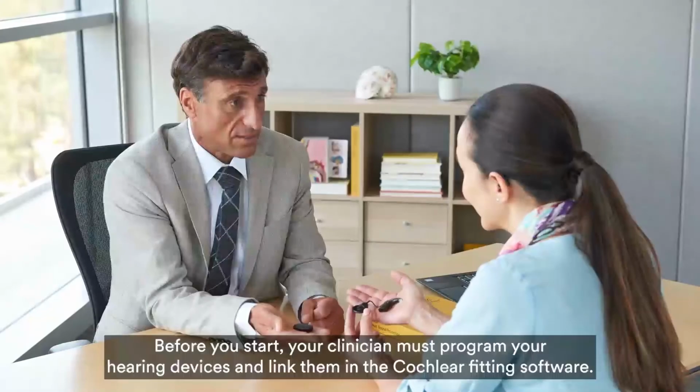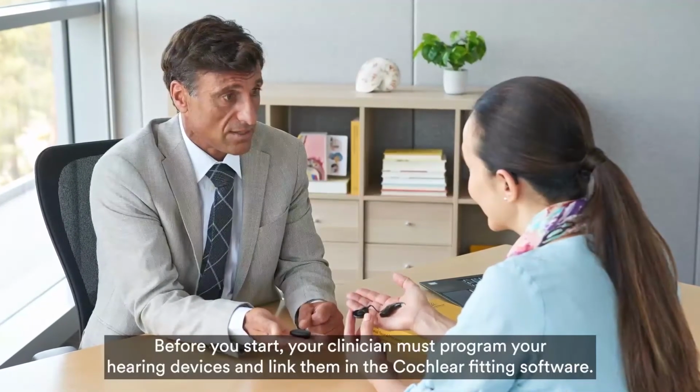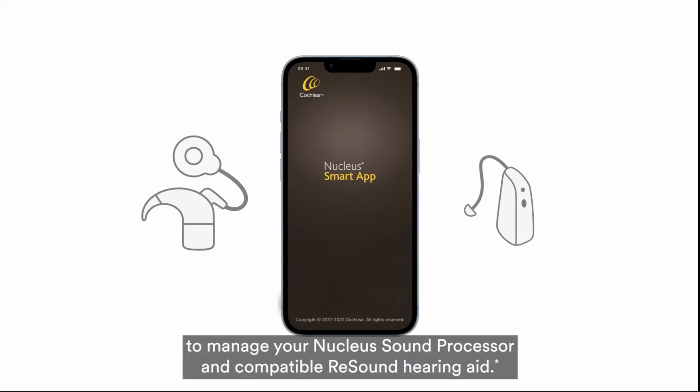Before you start, your clinician must program your hearing devices and link them in the Cochlear fitting software. When paired with a compatible Apple or Android device, you can use the Cochlear Nucleus Smart App to manage your Nucleus Sound Processor and compatible ReSound hearing aid.